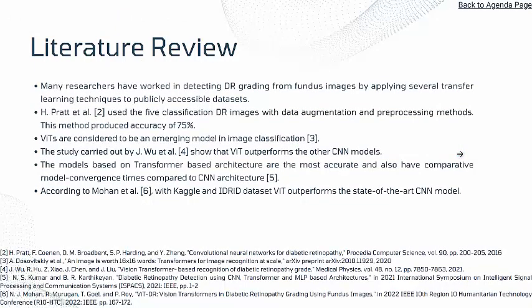In the literature, many researchers have worked on detecting the DR from fundus images by applying several transforms. Some research showed that with data augmentation and pre-processing methods, this could be as accurate as 75%. Some papers in the literature used CNN with augmentation and other transformations and tools.